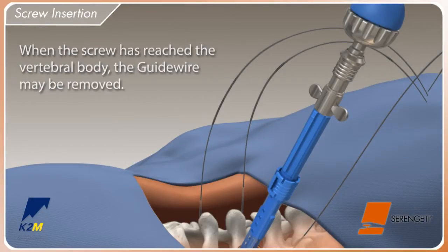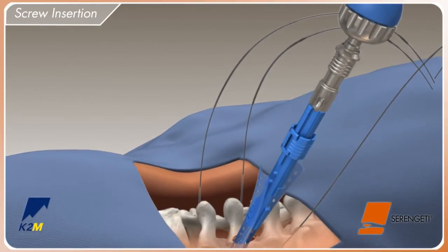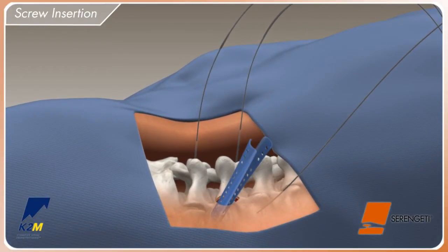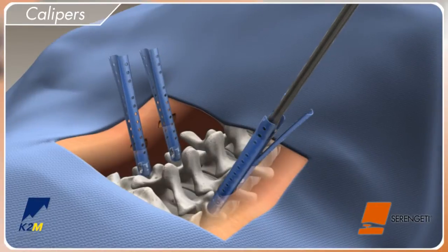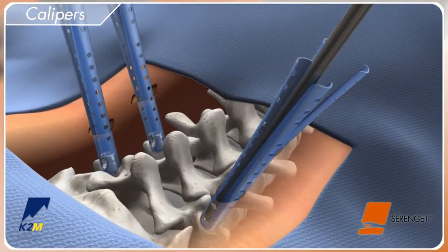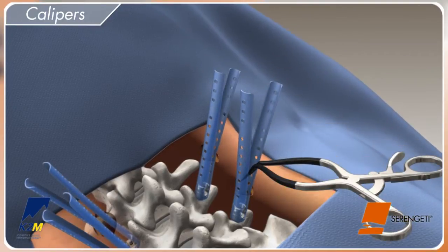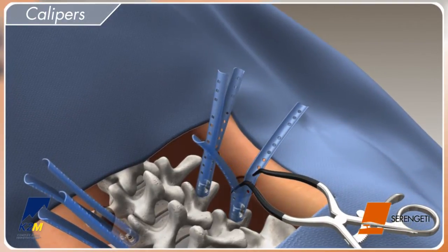Once the screw is satisfactorily positioned, pull up on the blue locking ring and spin the Mickey Mouse ears counterclockwise to disengage the Serengeti screw inserter. Prior to rod insertion, use the screw head adjuster to align the screw heads and place gelpy retractors one to two holes above skin level in order to open the Serengeti retractor.